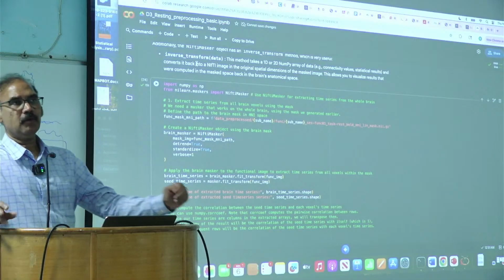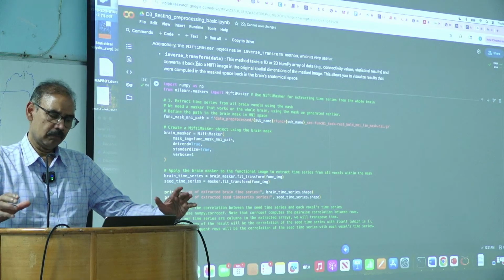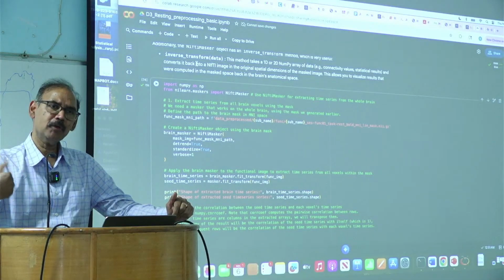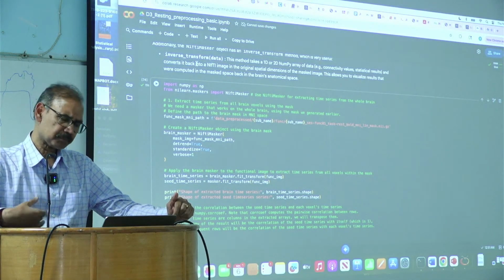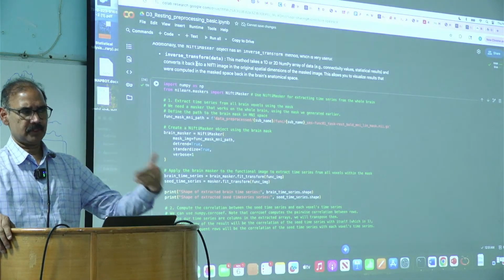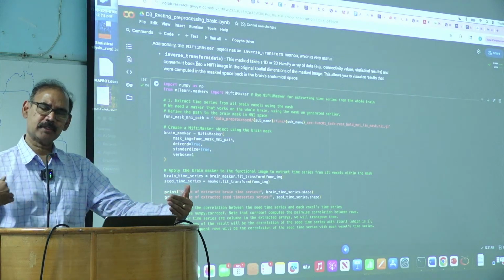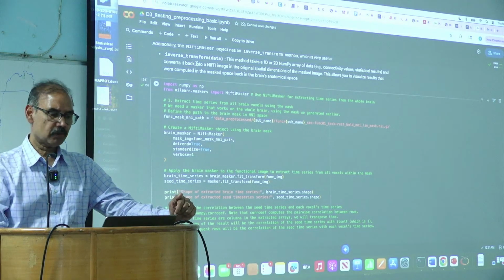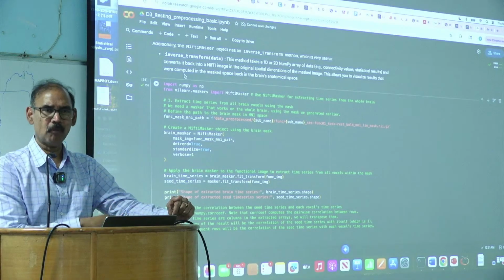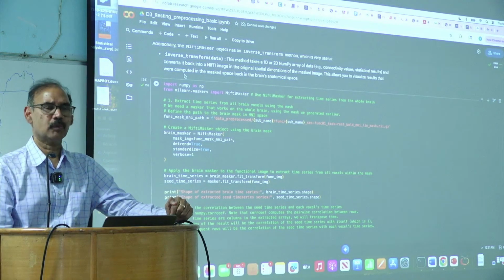When you are doing a task, let's say a motor task, it would only activate the motor region, but at the same time you don't know what you are doing to the other networks. Motor is a simple example and it would be okay. But let's say I was showing you disturbing pictures, like fearful pictures versus neutral pictures. During fearful pictures, it is quite possible that other networks, like my emotional network, would also get affected because I'm performing this visual task.